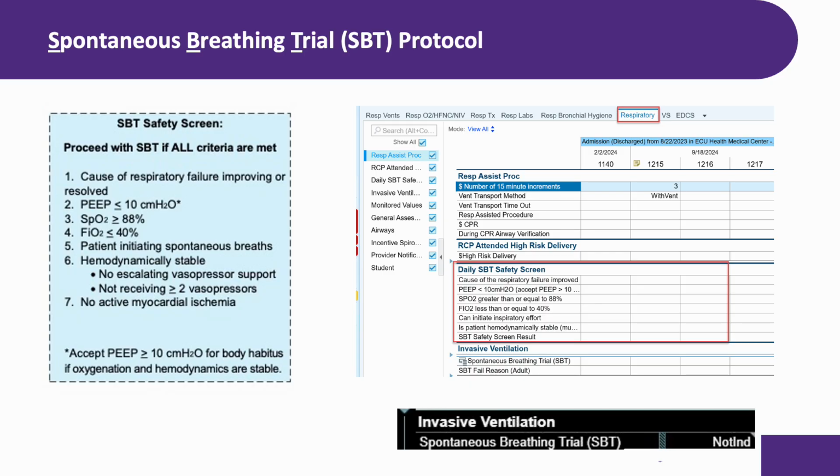criteria for SBT today. Now, this is something that makes our life easier because this invasive ventilation group with the SBT row is automatically populated on all of our adult mechanical ventilation patients. So you don't have to go searching for it or add it manually. It's already built within our documentation workflow for every vented patient.